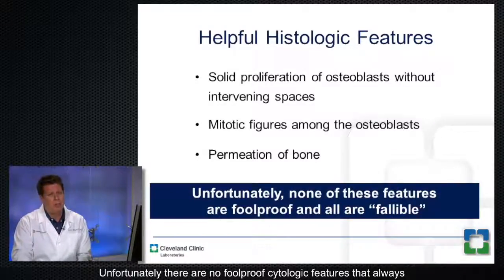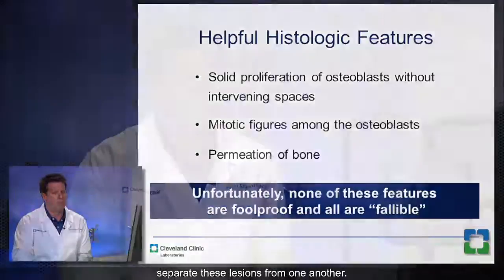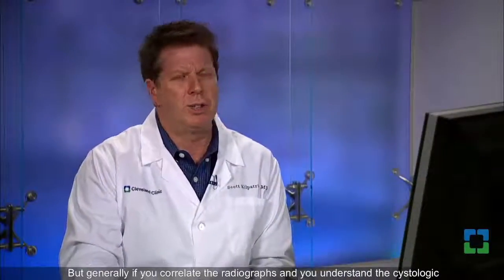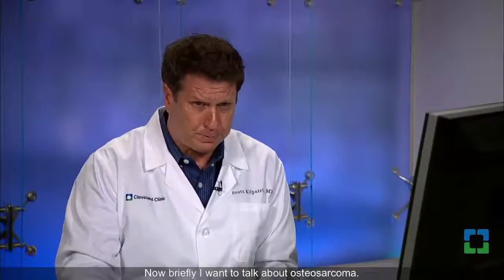Unfortunately, there are no foolproof histologic features that always separate these lesions from one another, but generally if you correlate the radiographs and you understand these histologic discriminating features, you'll be able to separate these lesions in the overwhelming majority of cases. Now, briefly, I want to talk about osteosarcoma.